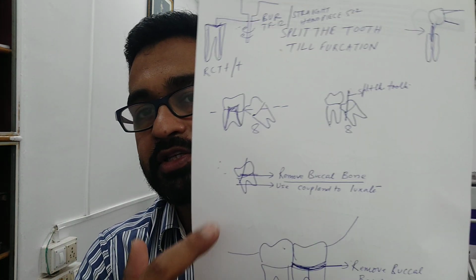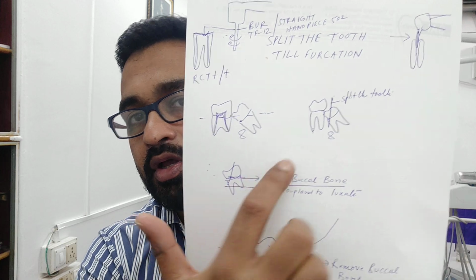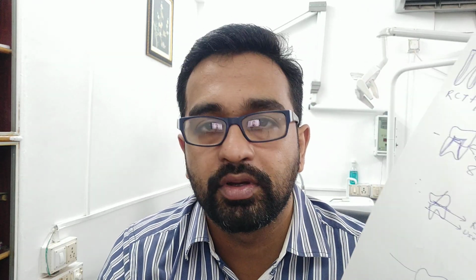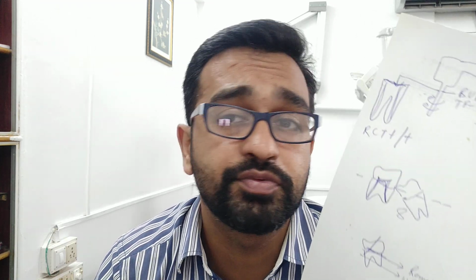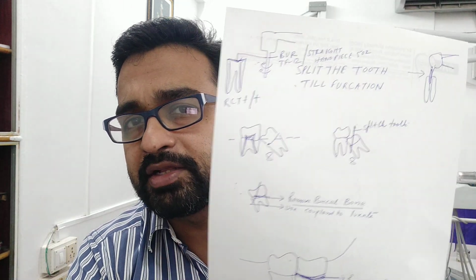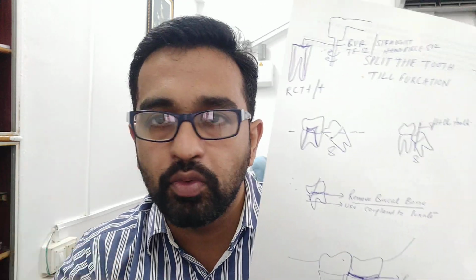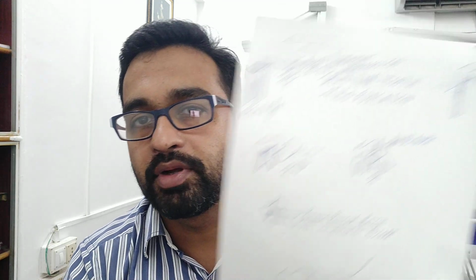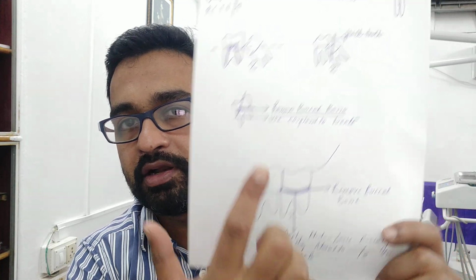Now next, after removing the lock portion, you have to cut the buccal bone. See, बोलना बहुत easy है, करना उतना ही मुश्किल. तो जब तक आप practice नहीं करेंगे, आपसे नहीं होगा. So you have to do it with confidence, and you need to have one more assistant with you, who will help you by giving all the instruments. So you have to practice. Slowly start with simple cases, then go into the difficult cases. I'm not telling you to do it right away, but you can try this also. This I'll tell after this.